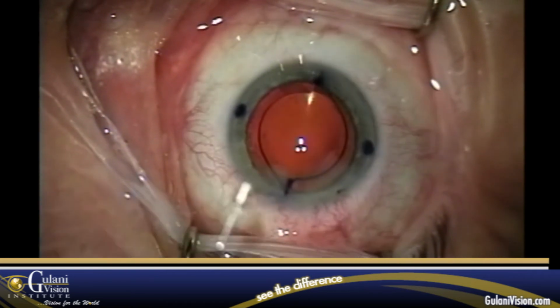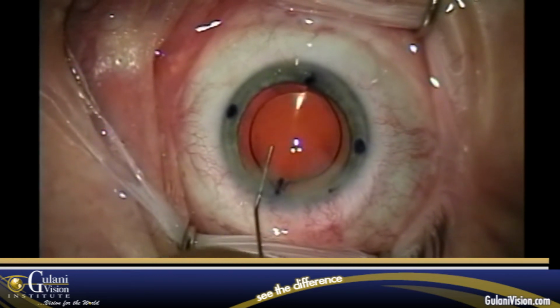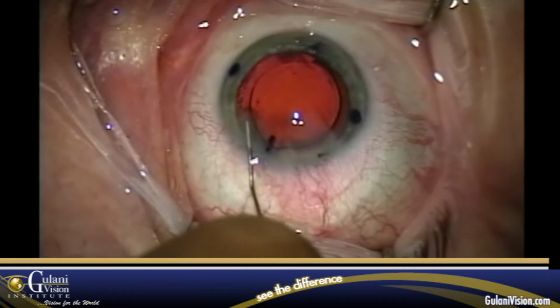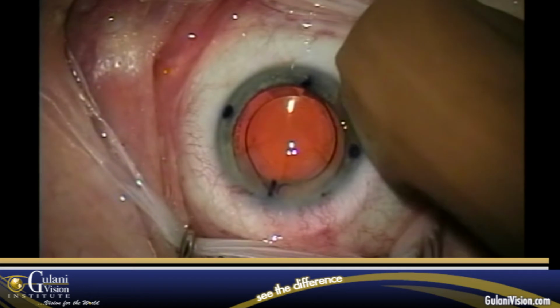Again, inject into the cornea and laterally into the arcuate incisions. Always make sure your lens is in place. Come back to sealing your paracentesis and incisions to a watertight closure.